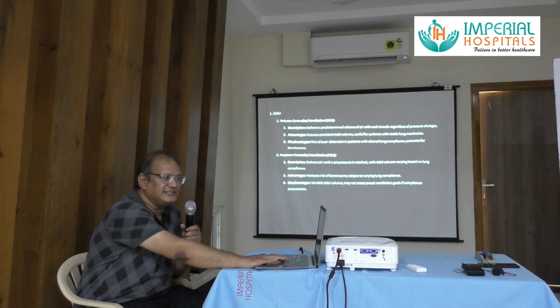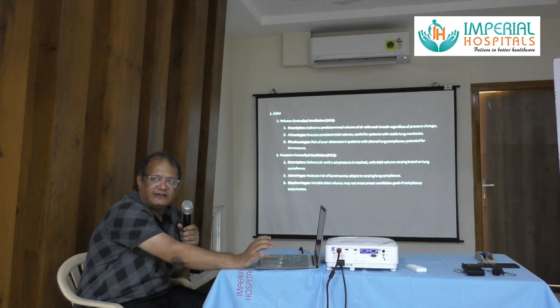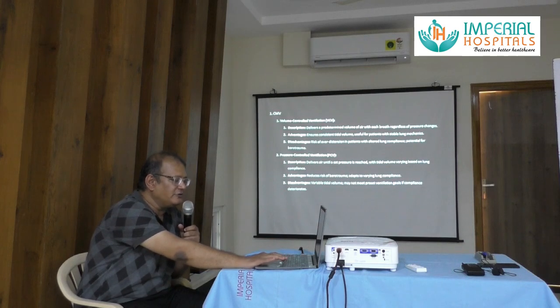Advantages are consistent tidal volume is set, and it is useful in patients with stable lung mechanics. Disadvantages, there could be over-distension in patients where lung compliance is altered, and there is a potential for barotrauma. Like the larger volume of air that is delivered, there is a chance of over-distension of alveoli and rupture.